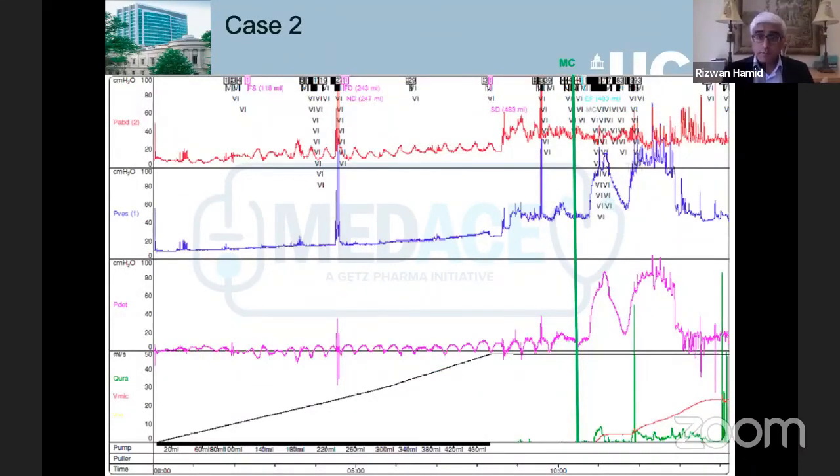Now this was a young man, so this is different. It's a young man, primary presentation, and I think most of us would agree that in a young man who comes with voiding dysfunction, this is my belief, I think it's a disservice not to do urodynamics and not to do video urodynamics before the treatment.